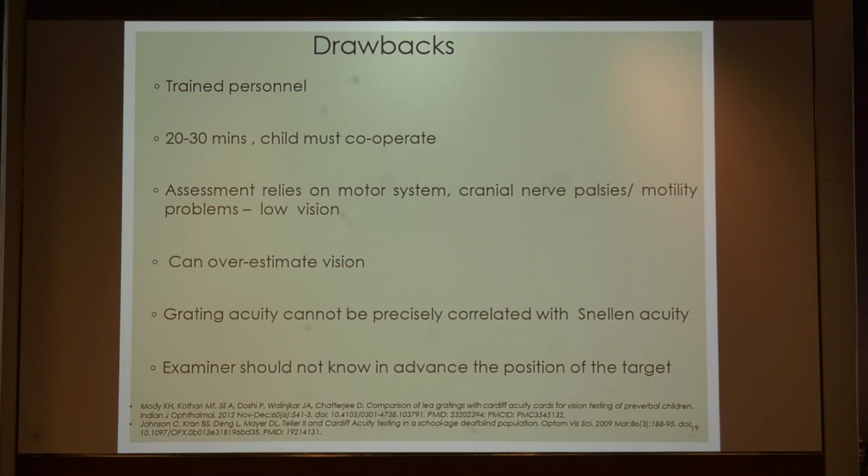Assessment does depend on the motor system. We tend to overestimate vision. Grating acuity cannot be precisely correlated with Snellen acuity. And here the examiner should not know in advance where exactly the position of the target is.